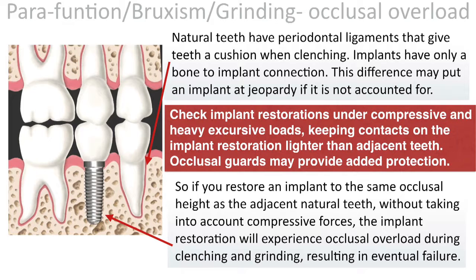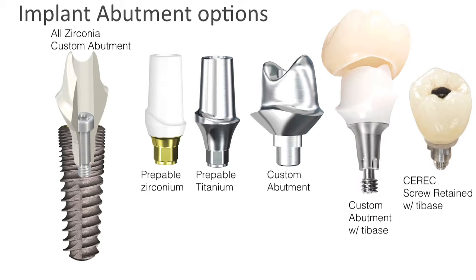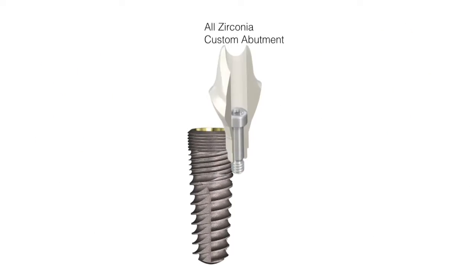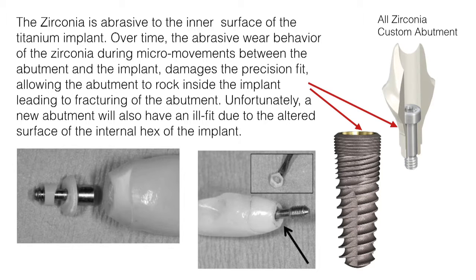All right, one thing I want to make sure you also don't do is use an all-zirconium custom abutment. For a while, a lot of us were doing that, using these custom abutments that were all zirconium, head to toe, no titanium insert at all. The problem is that the internal surfaces of the zirconium are abrasive, so you now have that abrasive zirconium inside the titanium, and there are micro movements that still occur. You think it's not going to move at all, but it does. Over time, that little movement will abrade the inside of the titanium, and you can't undo that once the process begins.